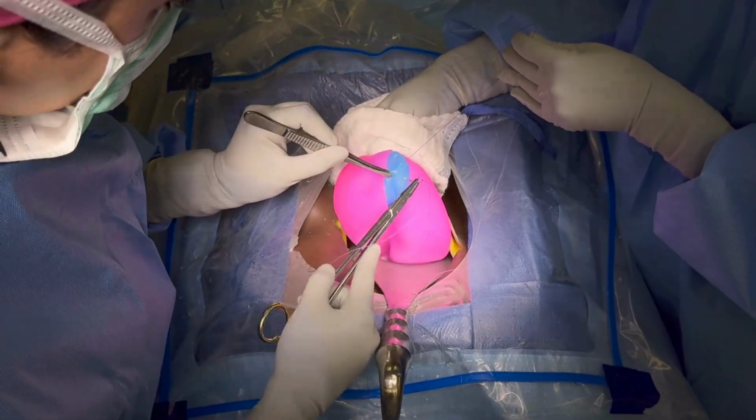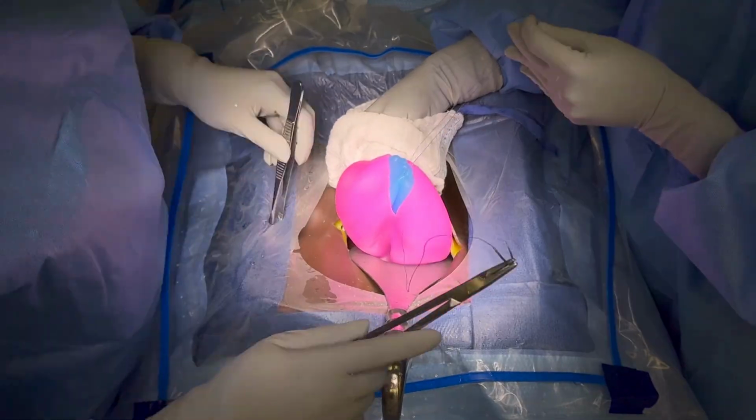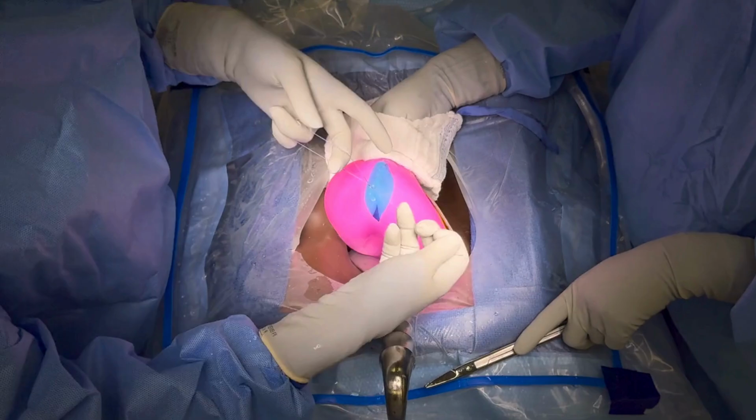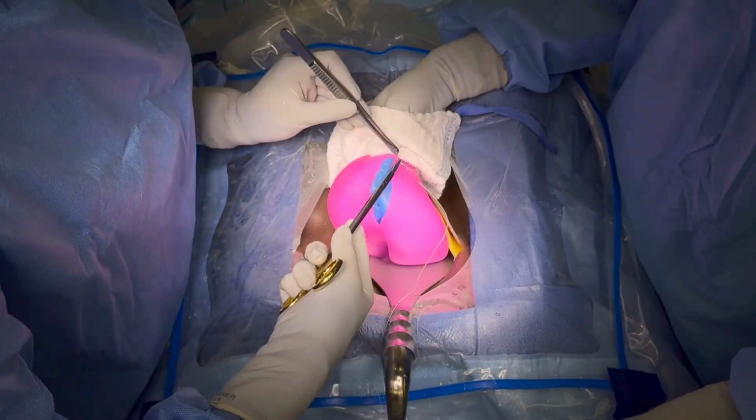To achieve good approximation and prevent the suture from tearing through the myometrium, it may be helpful to ask your assistant to relieve some of the tension by compressing the hysterotomy site on either side while the suture is being placed.